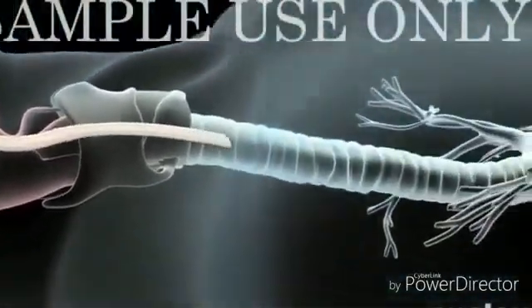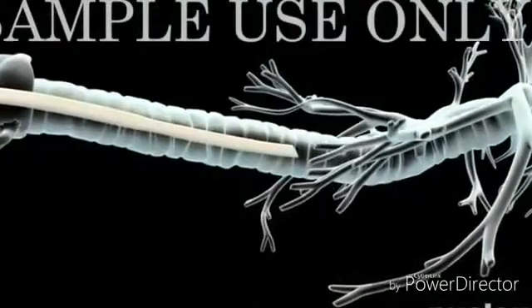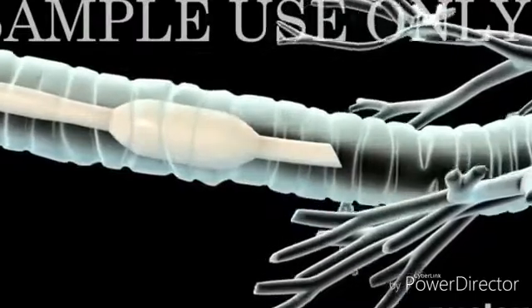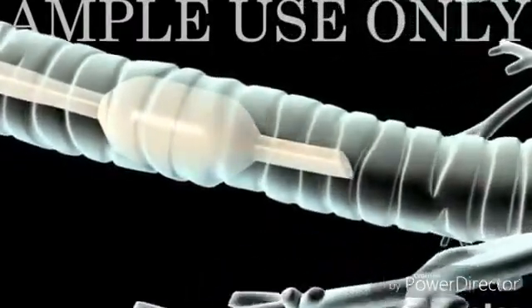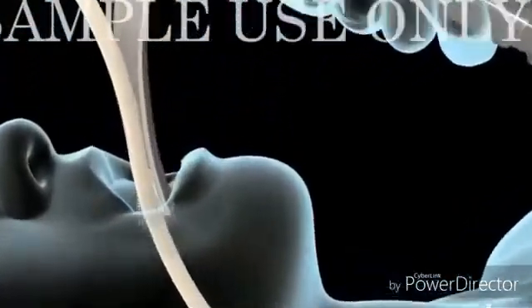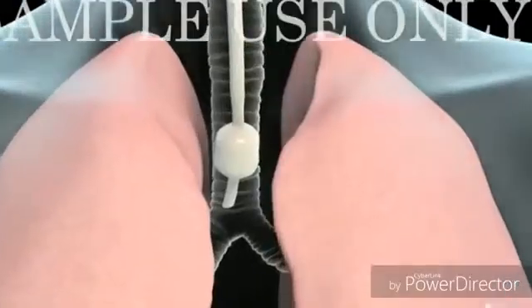The endotracheal tube should be introduced into the trachea. After the introduction of the endotracheal tube inside the trachea, you are supposed to inflate the bulb which is present distally at the end of the endotracheal tube. Now gradually remove the laryngoscope. After removal of the laryngoscope, the endotracheal tube is fixed at the corner of the mouth.